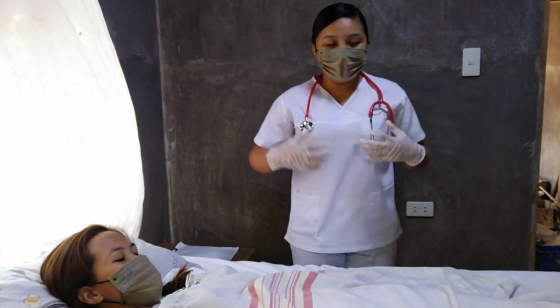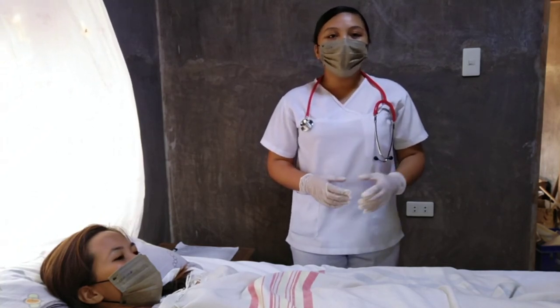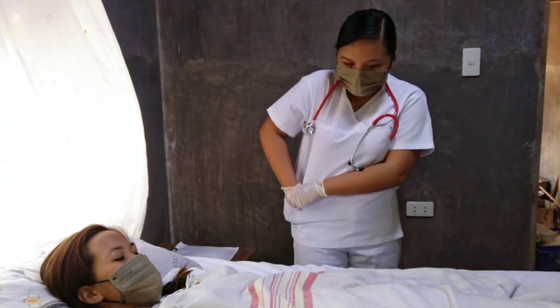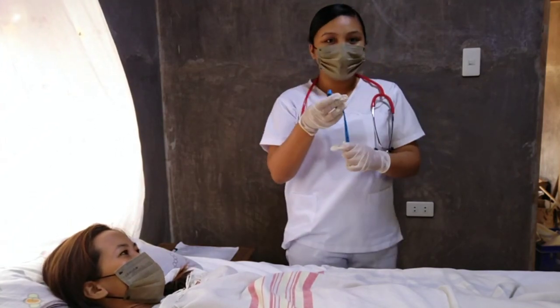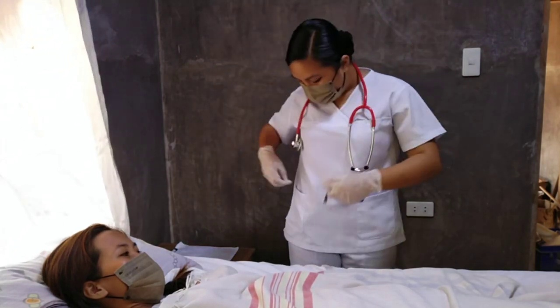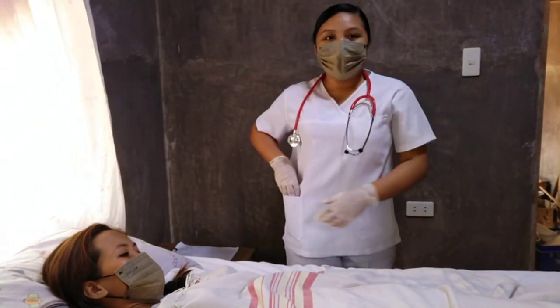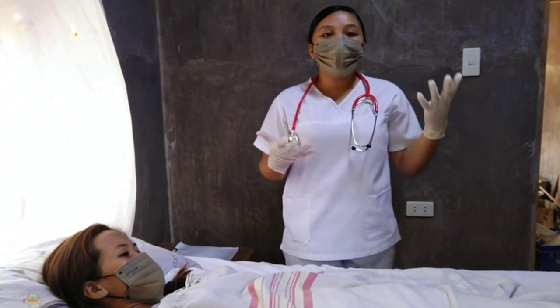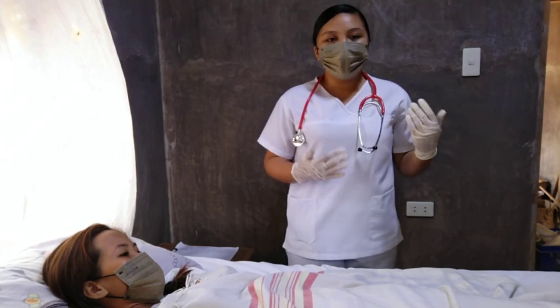For the equipment that we are going to use in assessing the abdomen, we are going to use the pillow, towel, a centimeter ruler, a stethoscope, and a marking pen. I have already done the proper handwashing and proper gloving.